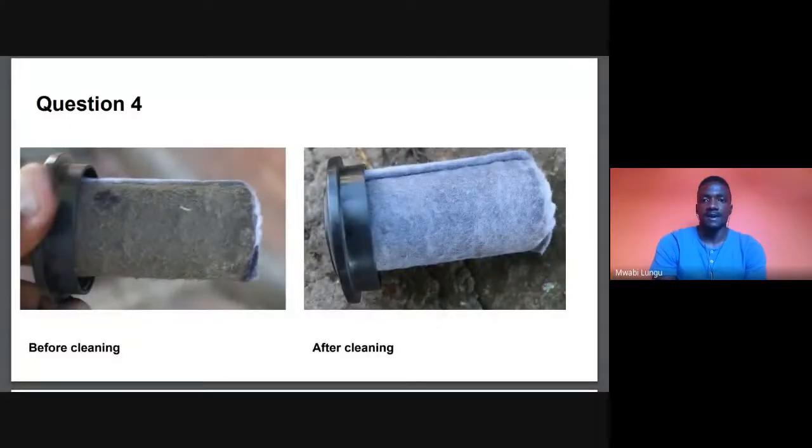I have an oxygen concentrator that I was doing some weekly maintenance on, and I discovered that the intake filter is very dirty. There is no obvious way of opening the filter to change the paper, so I tried to blow the filter with compressed air just to see if it will get cleaned. But this made very little change. Unfortunately, I don't have access to replacement filters as of now, and ordering online will take longer for the filter to get here. So as I wait for the replacement filter, can I run the oxygen concentrator without an intake filter? I'll ask Kowinda to take this question, please.